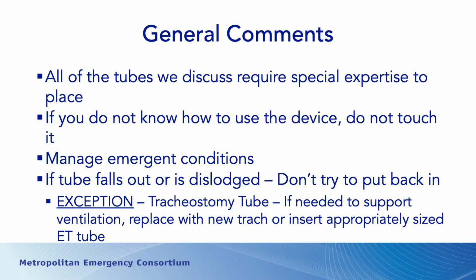If that happens, then you need to be comfortable with how you manage that tracheostomy tube. How do you reestablish the tube? Do you use a new tracheostomy tube if you have one available, or do you use an endotracheal tube to put in through the ostomy? You can use that to maintain the airway until the patient arrives to the hospital where we can put the appropriately sized tube back in place. So those are just some general comments for you to consider as we get through this conversation.